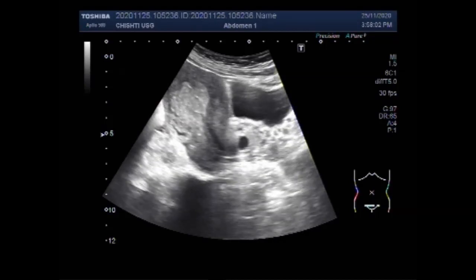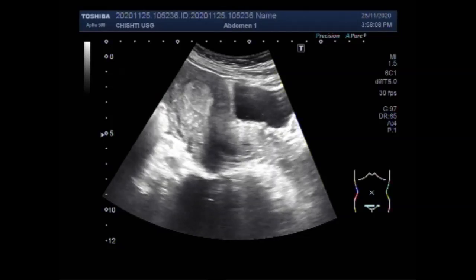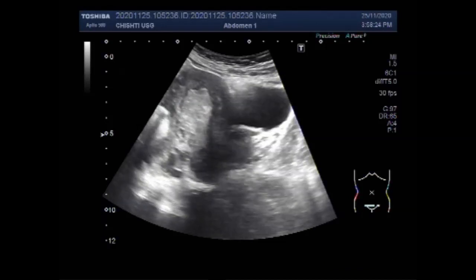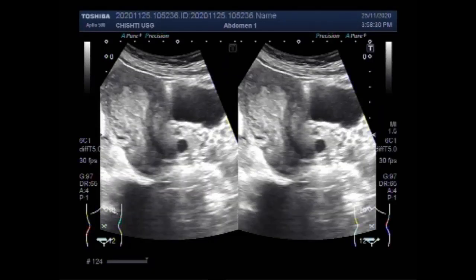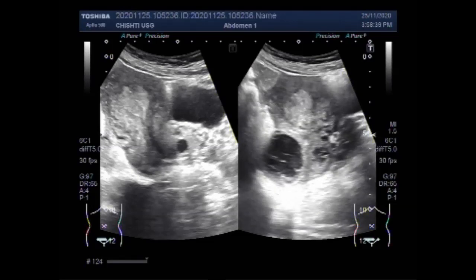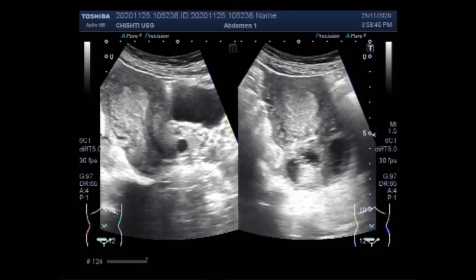Endometrial polyps can either be sessile or pedunculated. They can often be suggested on ultrasound or MRI studies, but may require sonohysterography or direct visualization for confirmation. You can see the cervical cyst. Classically, endometrial hyperplasia affects the entire endometrium and results in widening of the endometrium, while the uterine polyps may affect the endometrium in the distal portion of the uterine cavity.